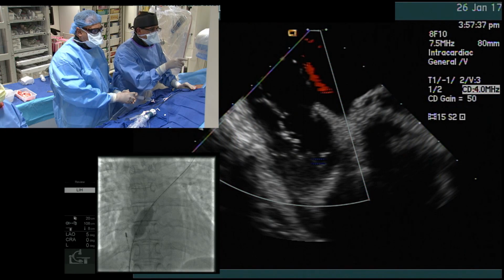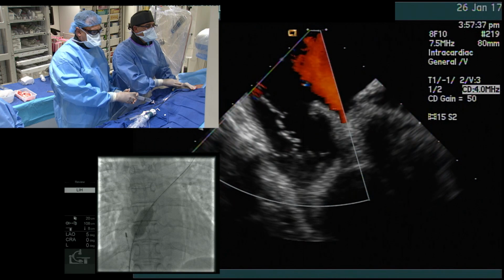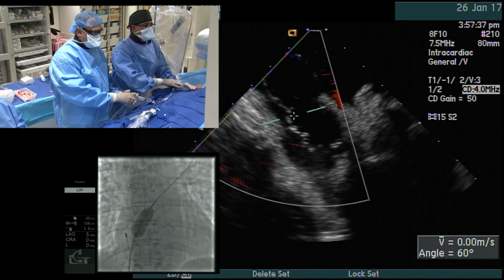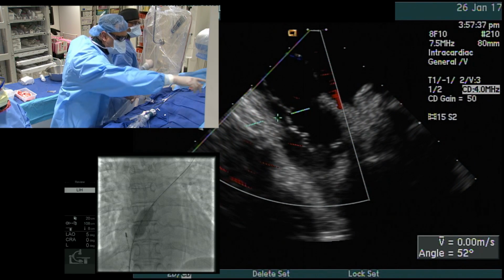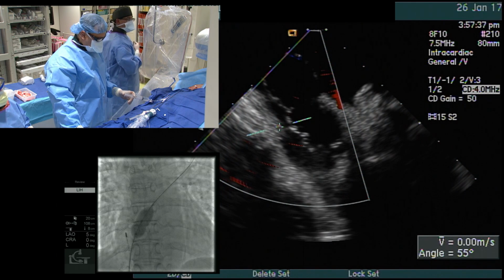So we measure from the indentation, yeah. Keep going, because I don't see the other side of the balloon. Yeah, that's good. So you can see, on the outside of the balloon, at the indentation. No, the indentation is in the center. Go a little bit to the right. Okay.